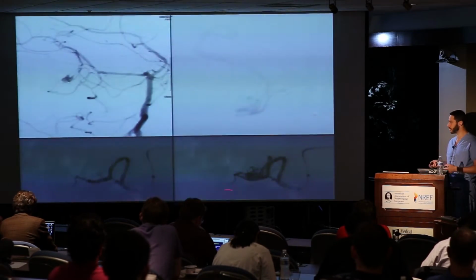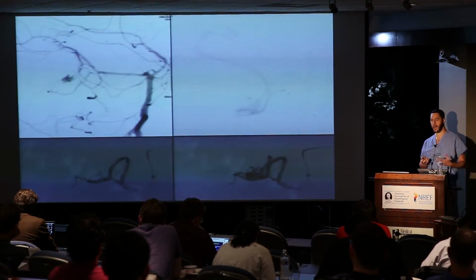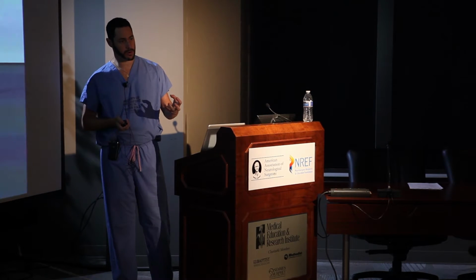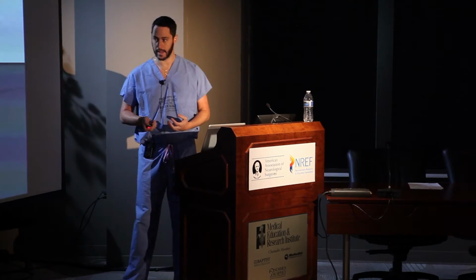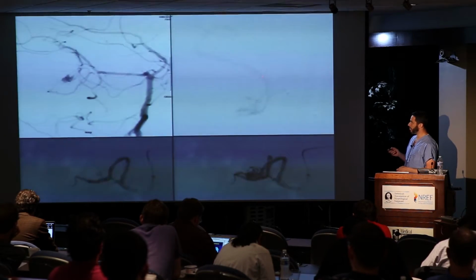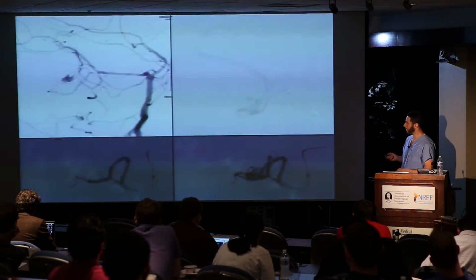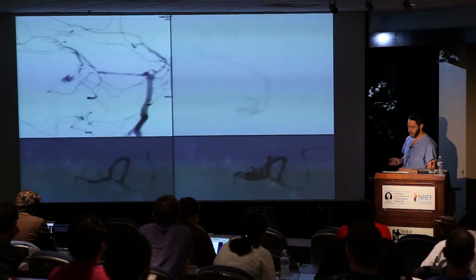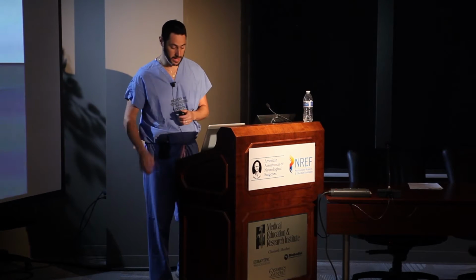This is to show you, if we are going to embolize curatively, then we need to do what was discussed, which is take the arteries going in, take the nidus, and take the veins. That's curative embolization, and that's why I put this on top of here, because I really think we got the pedicle, we have the nidus, and we have the vein coming out. That's where I was satisfied that I was done. Our kid's 25, he's had a 6-month follow-up, it's gone, and he's going to have a 5-year follow-up.